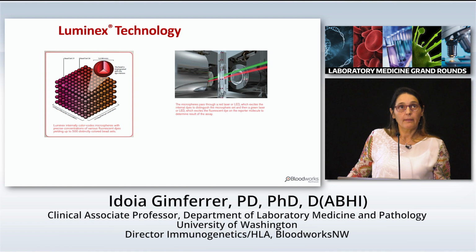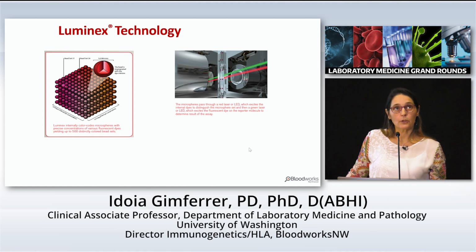This is the Luminex technology, and I don't know if you're familiar with this technology, but it's very versatile, and there are different kits available. It's based on the ability of having these beads, where every bead has a different combination of two fluorescent colors. So each bead has a different combination, so it's unique. When this bead goes through the Luminex instrument, which is a fancy flow cytometer, it gets activated and it's bright, and the software captures it and tells you which bead it is.